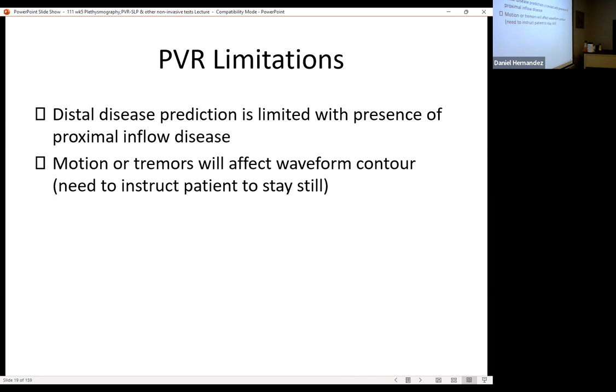That makes sense, because if all your pressures are abnormal, obviously it's nothing to do with the legs in a sense. It could be multiple locations in the legs and you wouldn't be able to really tell.